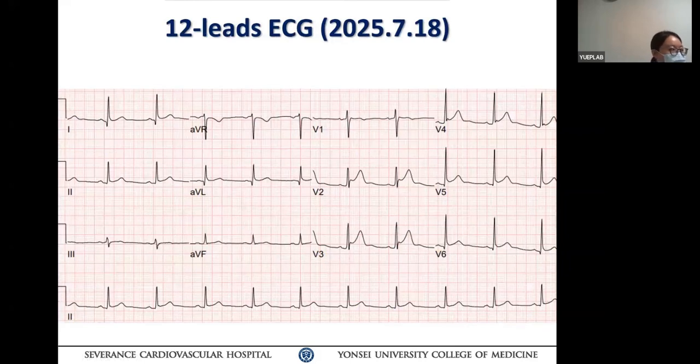So, yeah. Even sinus rhythm is not that. The progression is normal. Okay. So why does the patient have ST segment elevation in V2, V3, V4, V5, V6? What's the reason? In sinus rhythm, also in lead 2, the ST is elevated. And then, I'm sorry, no, this ECG is post-procedure, I don't know.